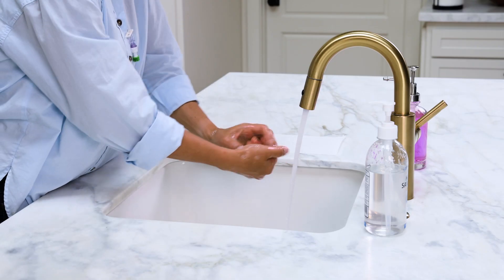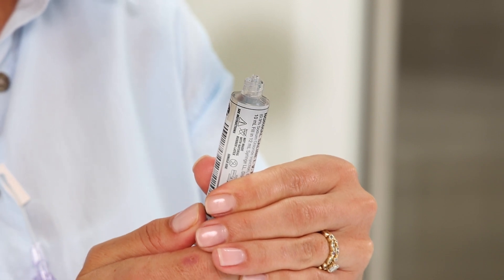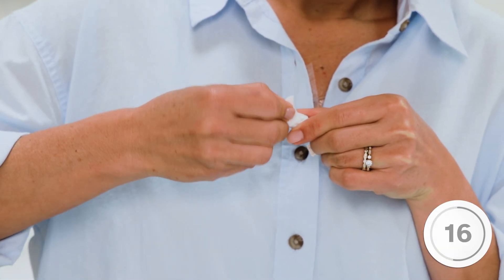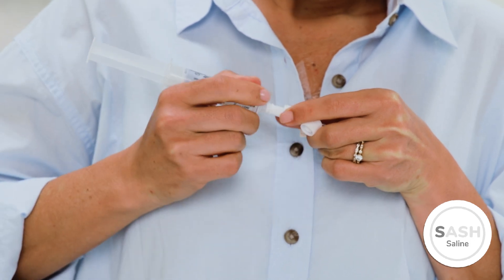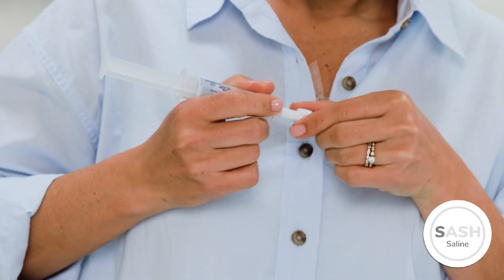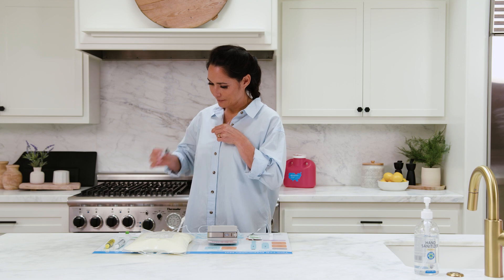You are now ready to flush your IV catheter with the saline solution. First, wash your hands or use an alcohol-based hand sanitizer. Remove the cap from one of the saline syringes and, with the tip pointed upwards, push the plunger to expel any air. Clean your injection cap with an alcohol pad for 30 seconds and let it air dry for 10 seconds. Attach the syringe to your IV catheter by pushing and twisting clockwise, then open the clamp on your catheter. Flush your IV catheter with saline using the push-pause method until completely flushed. Remove the syringe and discard it in the trash.